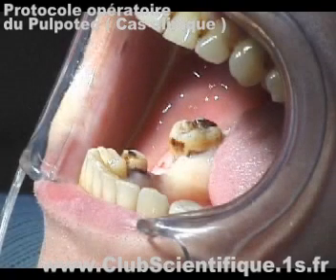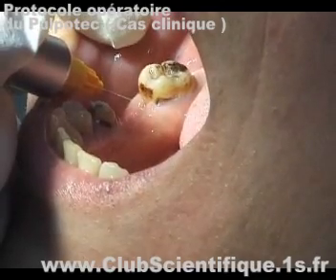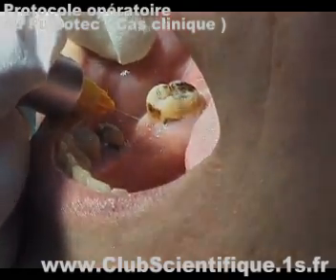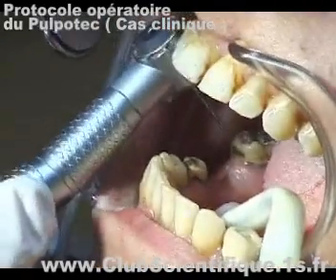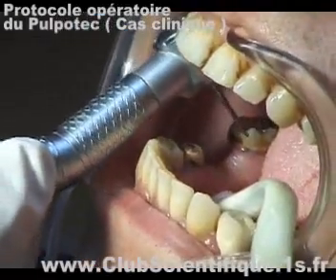The second case shown is a pulpotomy performed on tooth number 47 used as a bridge abutment. Again, the first step is the anesthesia of the tooth, followed by the removal of the roof of the pulp chamber with an X-long surgical burr number 200.